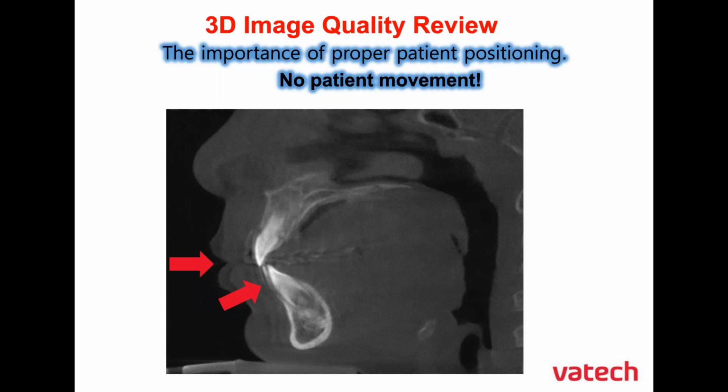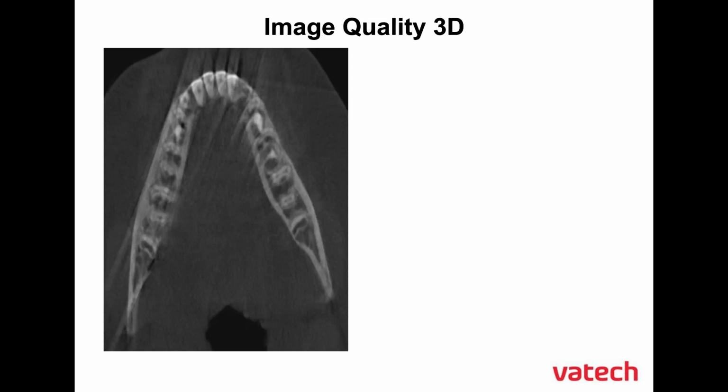And I think this next slide shows us more from an axial cut where we have some ghosting. And see that streaking effect through there. We'll really get that streaking off of that hard tissue. That's going to show us those issues. Right, and the graininess a little bit is from that as well. Yeah. And now, I would like to see a really nice clean image, so let's look at that next.